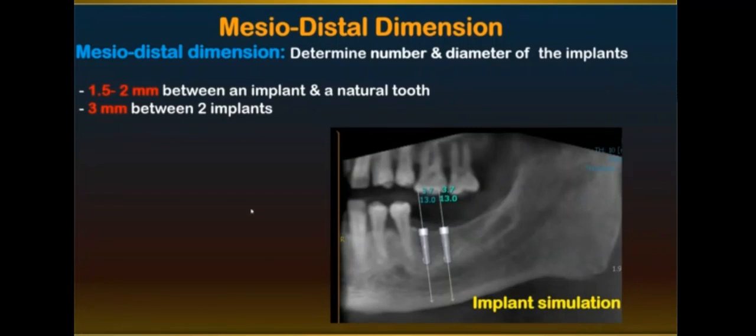Is it possible to make a prosthetic planning suitable with this case or no? So I'm not strict with these numbers, because, for example, if I have 2 neighboring premolars, the distance between them is going to be different than 2 neighboring molars, or a molar next to a premolar. All of these cases, each case has its own agenda.